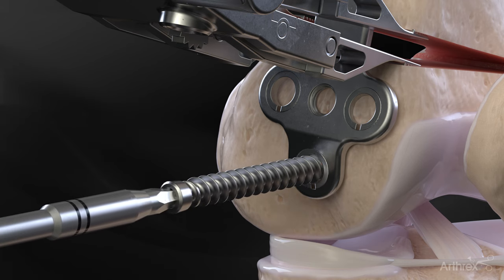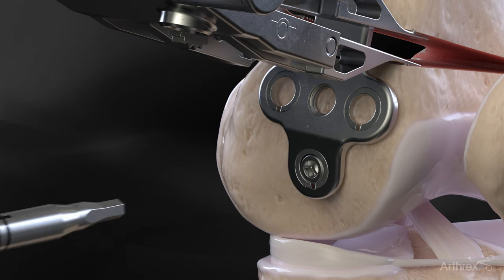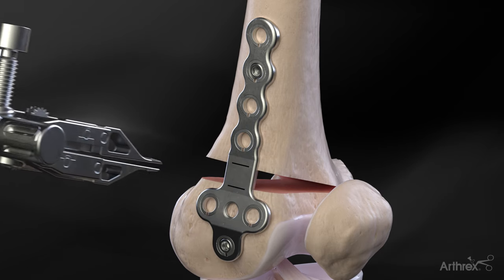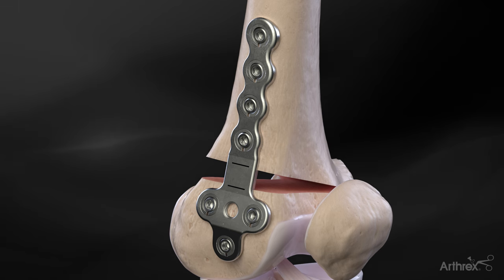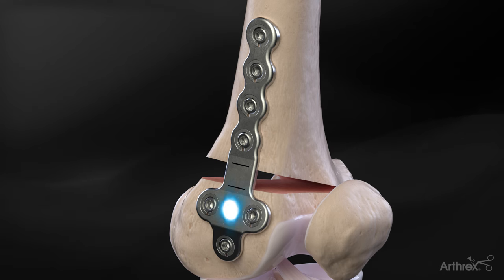Three 6.5 mm cancellous screws are placed in the plate distal to the osteotomy. Four 4.5 mm fully threaded bicortical screws are used to secure the plate proximally to the osteotomy. Conventional fluoroscopic technique should be used for pre-drilling and depth measurement to determine appropriate screw length and position. A fourth optional fixed-angle locking screw may be inserted distally if additional fixation is deemed appropriate.